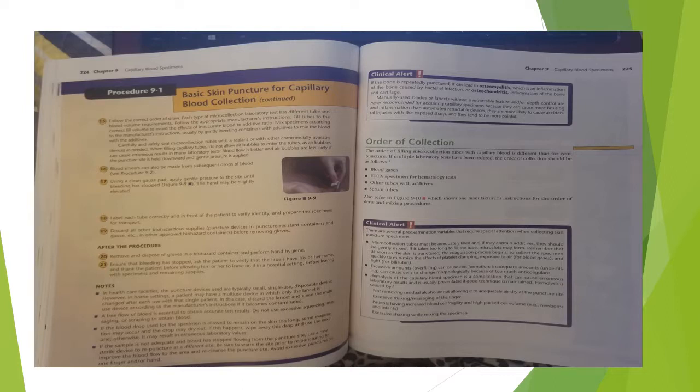Basic skin puncture for capillary blood collection continued. Follow the correct order of draw. Each type of microcollection laboratory test has a different tube and blood volume requirement. Follow the appropriate manufacturer's instruction. Fill tubes to the correct fill volume to avoid the effects of inaccurate blood to additive ratio.